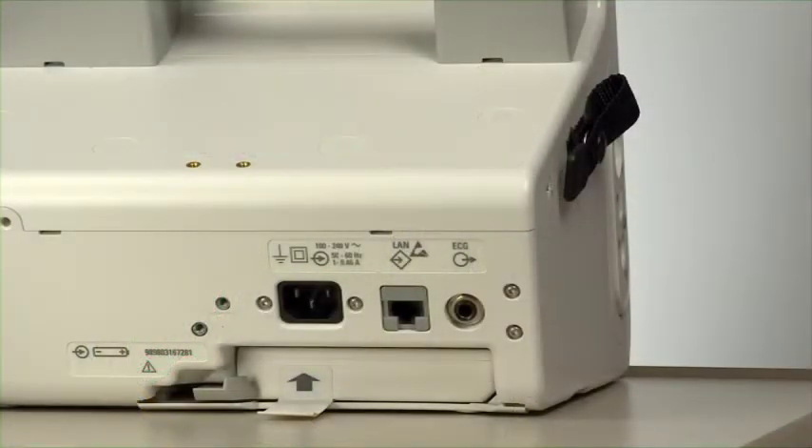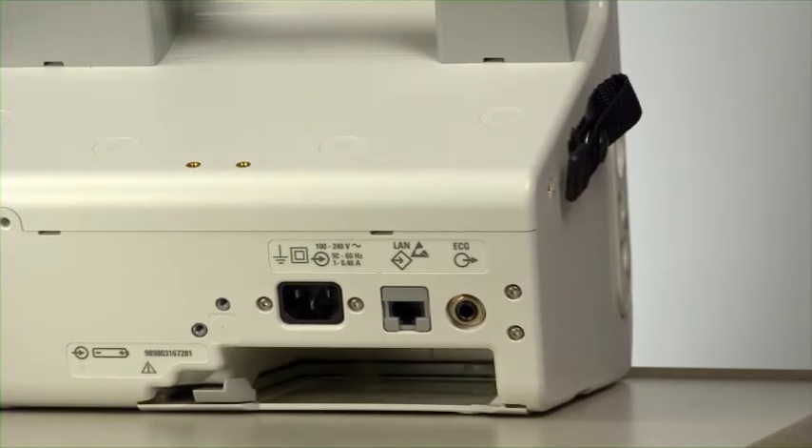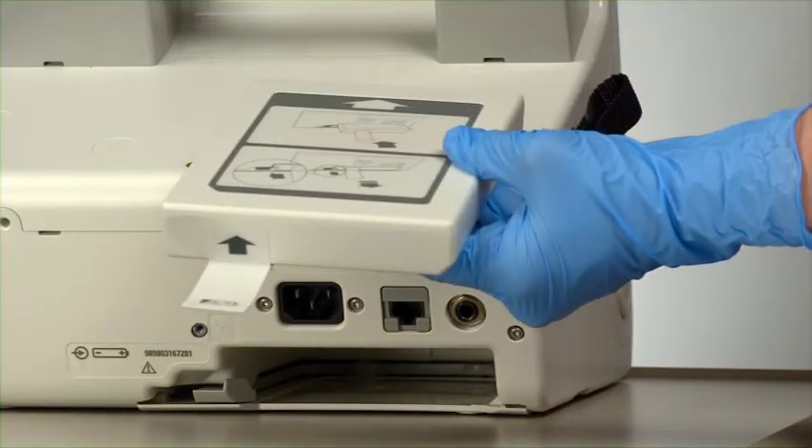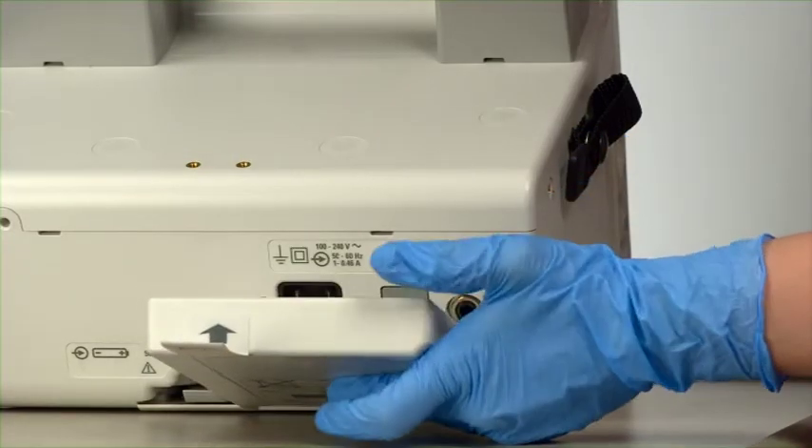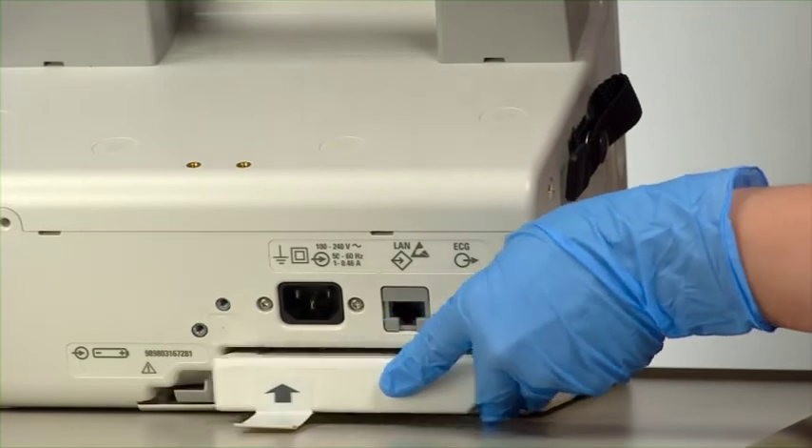The XL Plus is powered by a rechargeable lithium-ion battery. The compartment on the back of the XL Plus houses the battery. To install the battery, align the lithium-ion battery in the battery compartment with the arrow on the battery tab pointing up. Insert the battery until you hear it click into place.